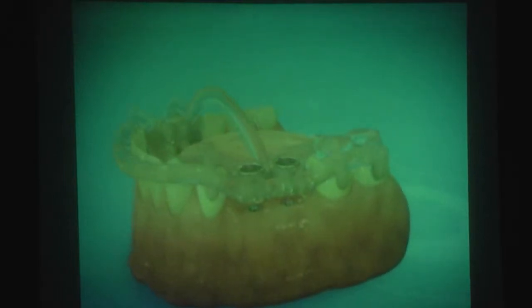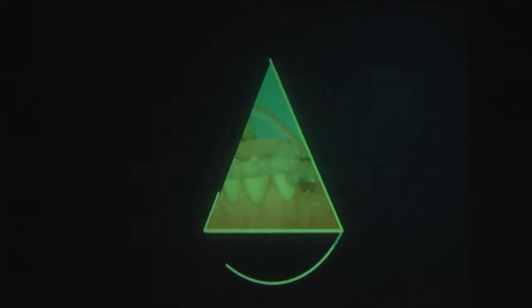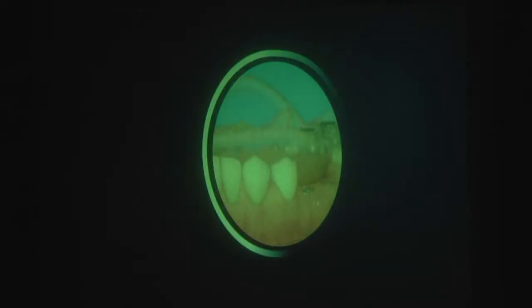And now, the end is near, so I face, I'm sorry, the final curtain. No, not the final curtain. So we're finished. After it, we have 2 options. For example, if you place the implant with a low torque and it doesn't have any primary stability, then you can put the excised part again, and maybe you can use a glue, maybe you add a stitch, but it must be a monofilament stitch.